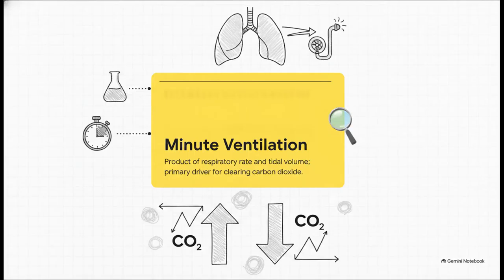So, the really crucial point here is minute ventilation. It's just the product of respiratory rate multiplied by tidal volume. Minute ventilation dictates exactly how much CO2 you blow off. If your patient's ABG shows they're retaining CO2, you've got to increase that minute ventilation. If they're blowing off way too much, you decrease it. It really is that foundational.